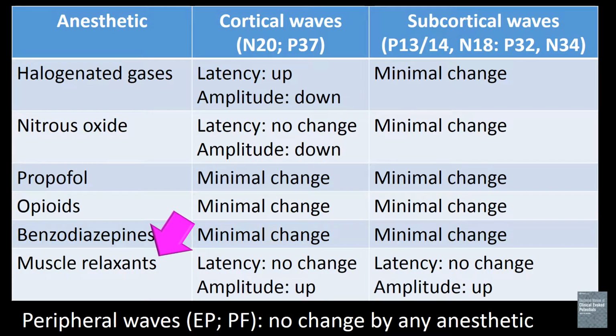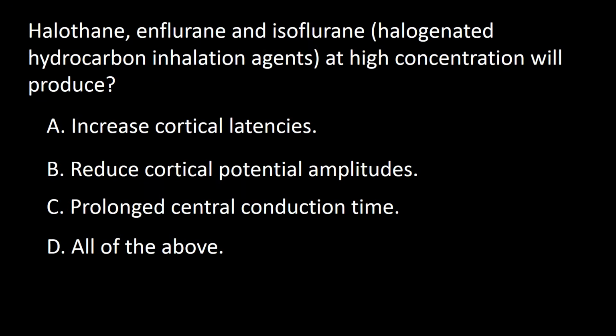Muscle relaxants produce no change in latency but allow better wave averaging, thus producing higher amplitude waves. So the answer to this question is D.